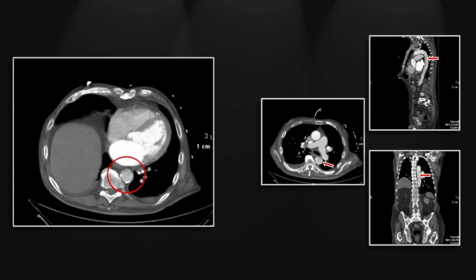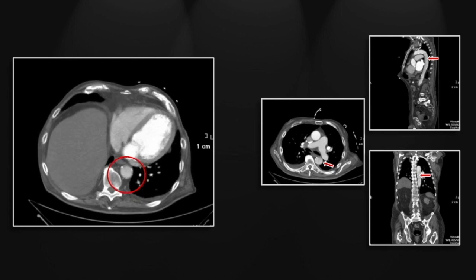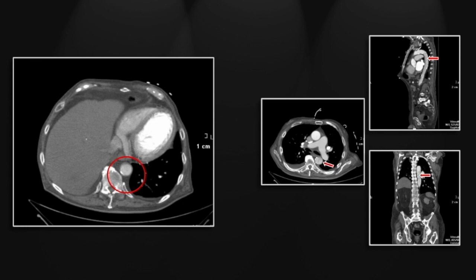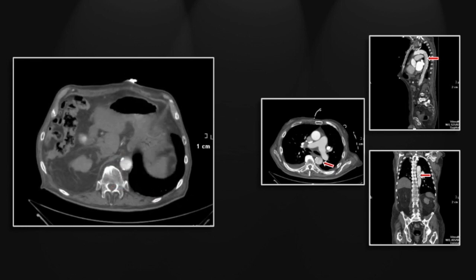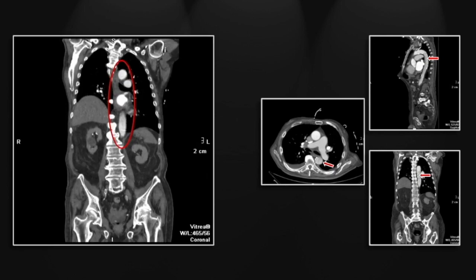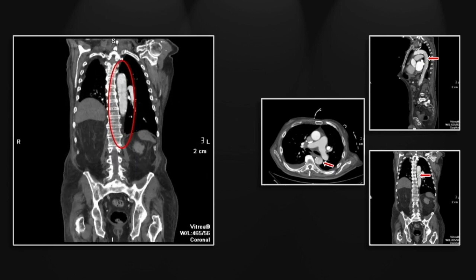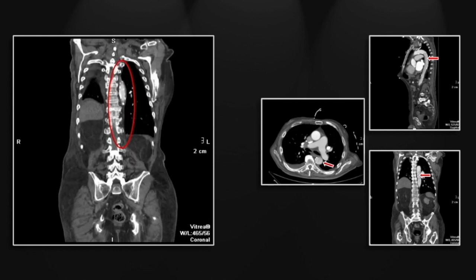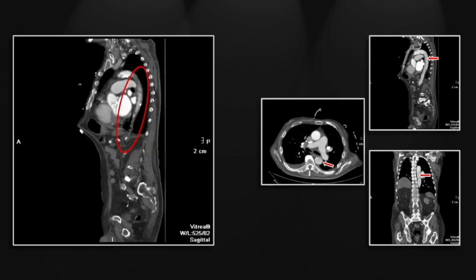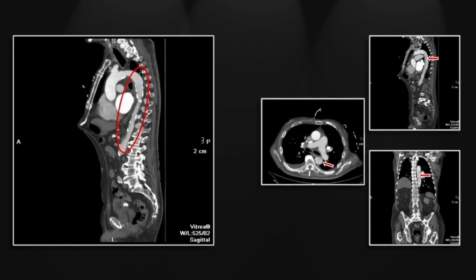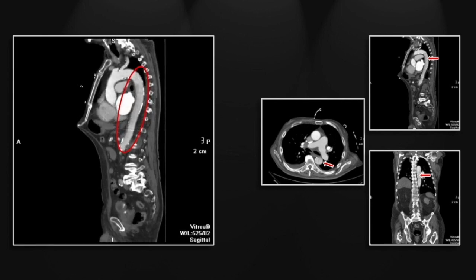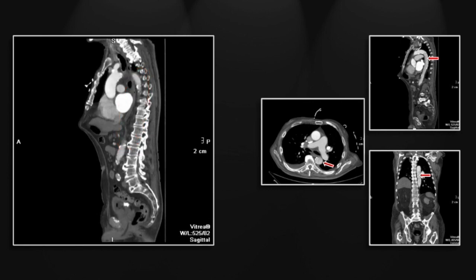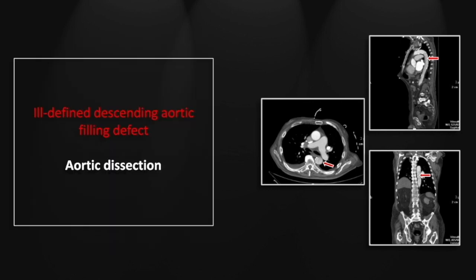It is quite extensive — a very difficult call given its subtlety on any given cut. You can really appreciate its linear nature if you watch closely. It is visible on the coronal and best appreciated on the sagittal. So that is a very challenging, subtle aortic dissection.